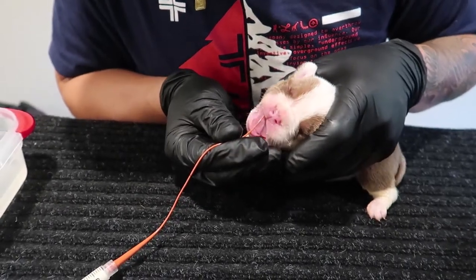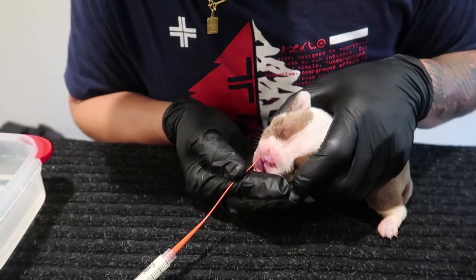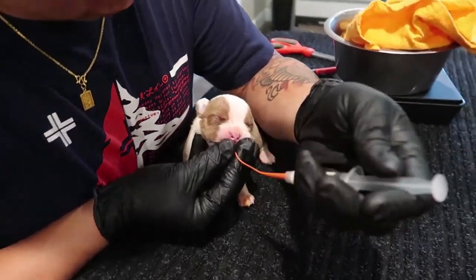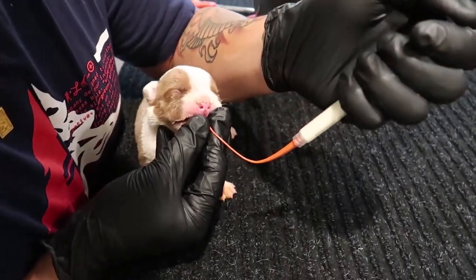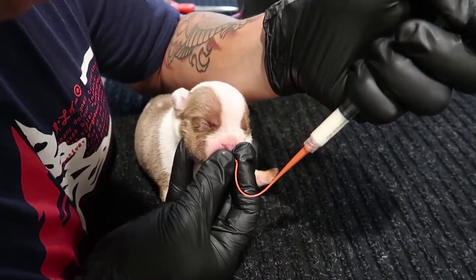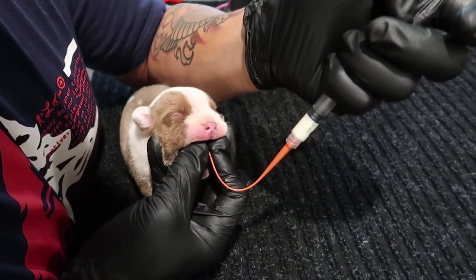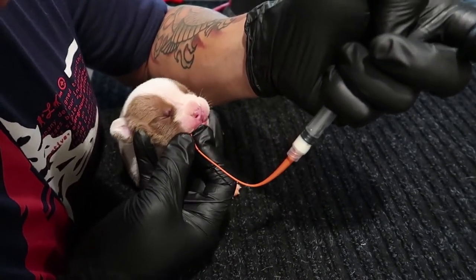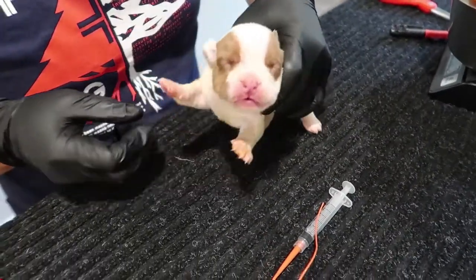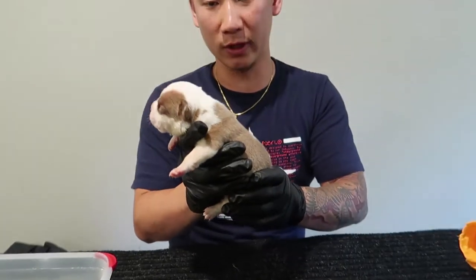Push that tube slowly in there — she's swallowing it. There goes our mark right there, so we're going to leave it right there. Then just slowly press the milk in. Once you press it down and you know they're not coughing, it's in the right place — it's in her stomach for sure. Perfect. Then just slowly pull it out, and you can see her stomach got a little bigger. And that's how you tube feed a puppy.